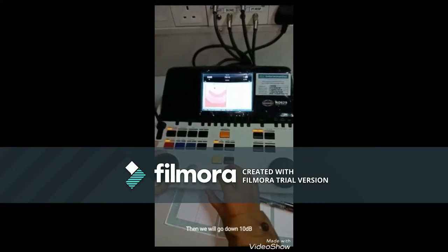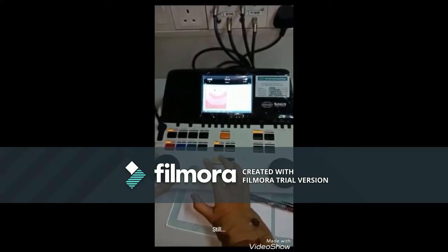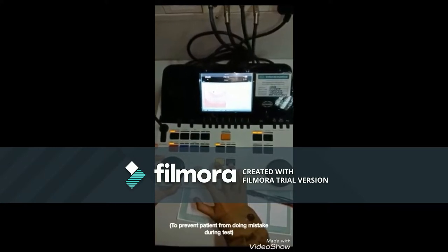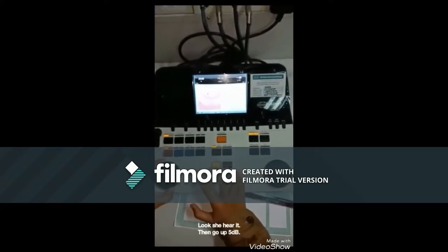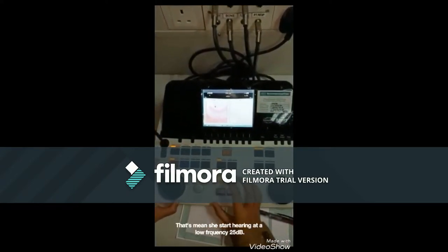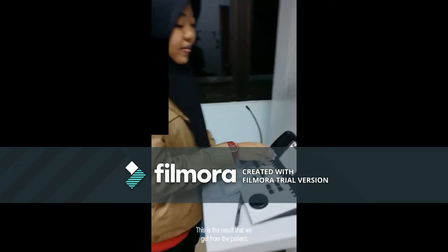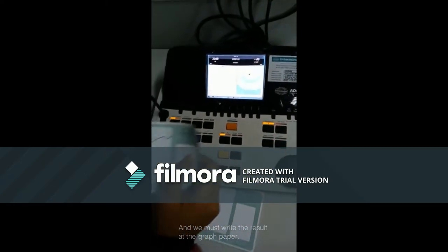Then we will go down 10 dB. Still, then 10 again. Okay, look, see, she hears it, and then go up 5. Okay, she's hearing, so that means she starts hearing at the low frequency at 25 dB. Okay, this is the result that we get from the patient. We must write the result on the paper graph.